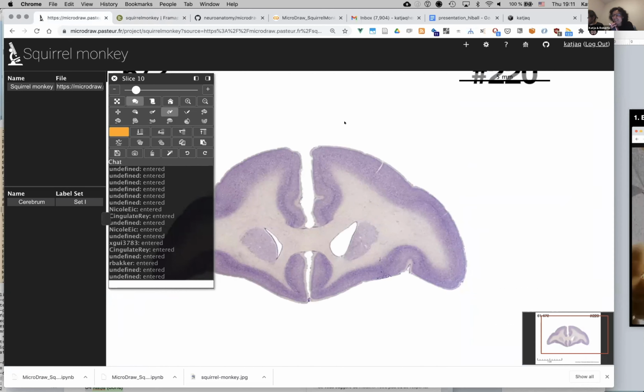What a surprise, how nice. I see the cerebellum is already done in several slices. We have our cerebellum expert attending the workshop. Everybody meets Sophie Falk. I don't know if she can say hi somewhere.